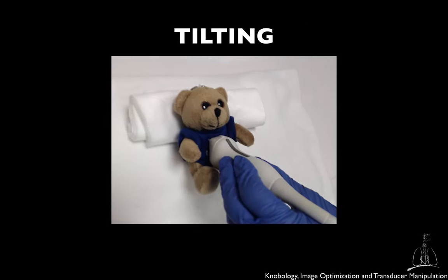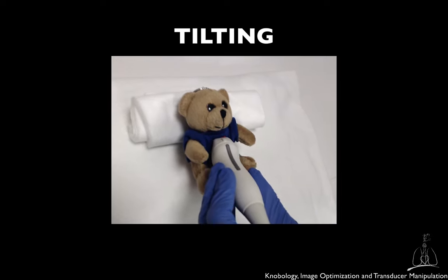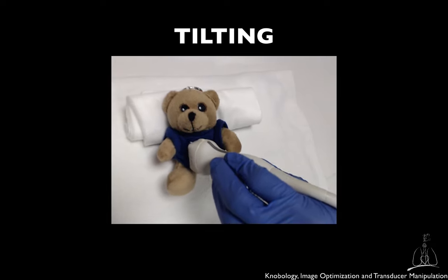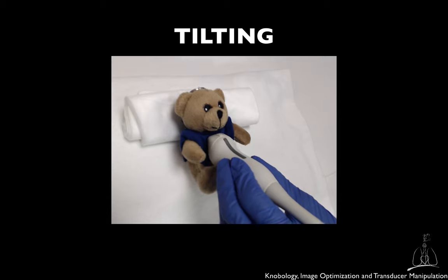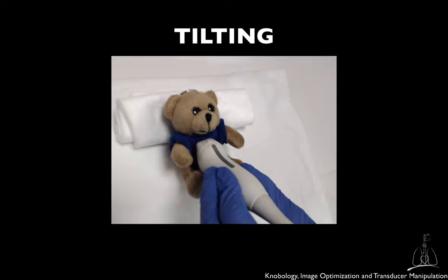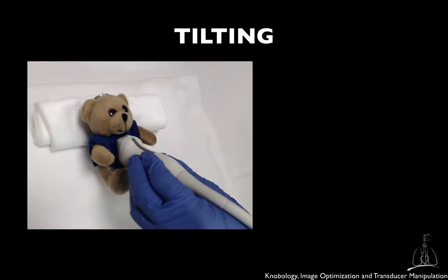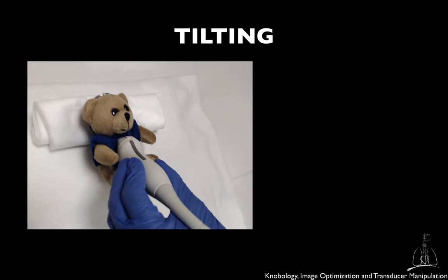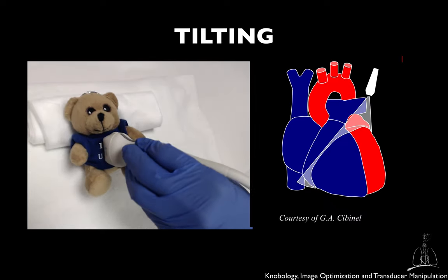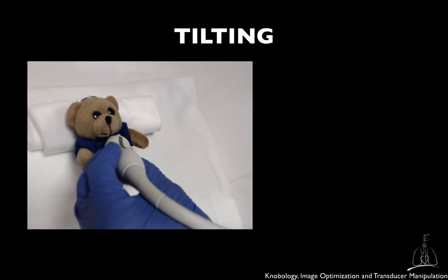In contrast, tilting refers to a movement of the probe in a plane perpendicular to its main axis along a fixed point on the body while changing the angle of inclination. Tilting is therefore a motion that is perpendicular to rocking. Tilting the transducer allows visualization of different planes in the same axis without sliding the transducer on the body — for example, from the base to the apex of the heart in the parasternal short axis view, or of the IVC and aorta in the subcostal longitudinal view.